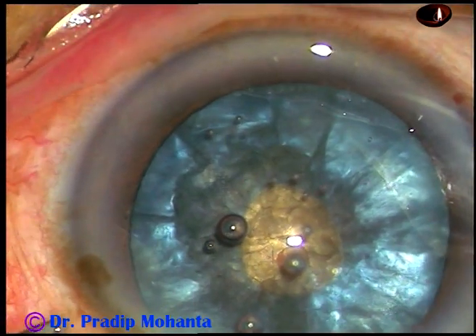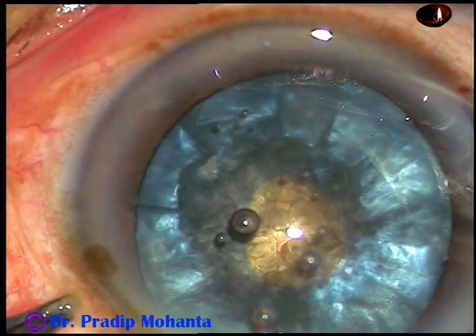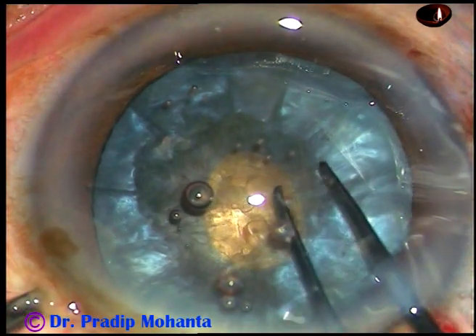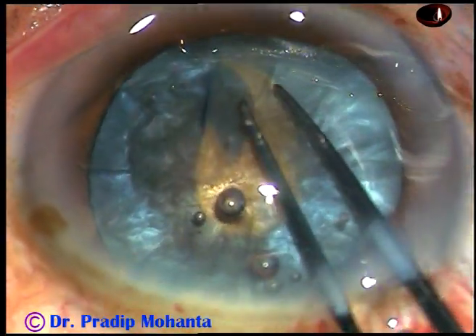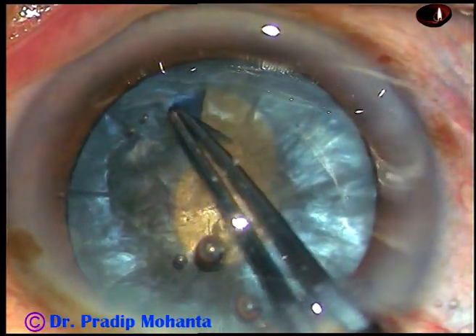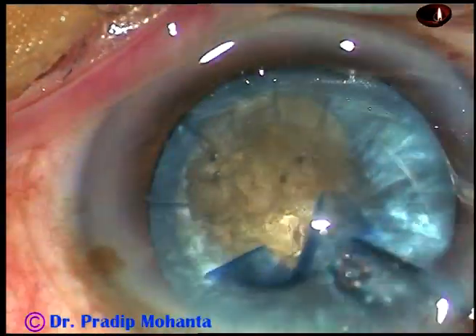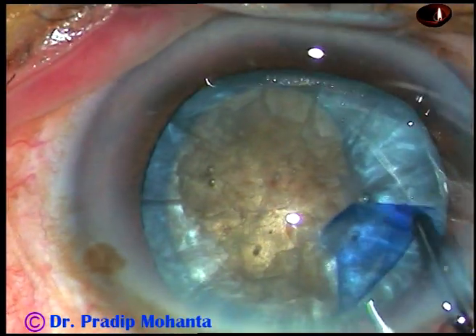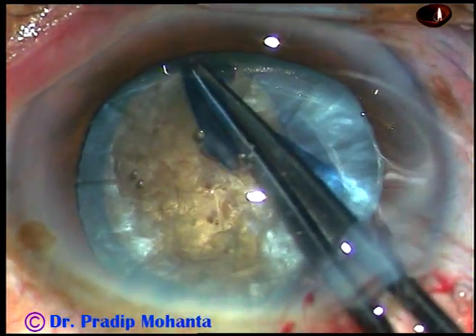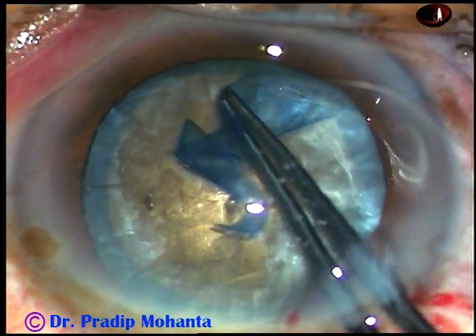Viscoelastic has been injected again. Now, this is a small nick at the margin of this small rhexis. I take the utrata again, hold this tag and convert this small rhexis into an adequate-size rhexis. In this case, since the cataract is very hard, I opted for a large rhexis, about 6 mm in size.